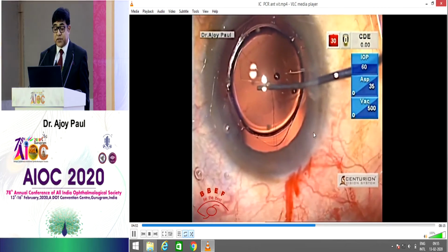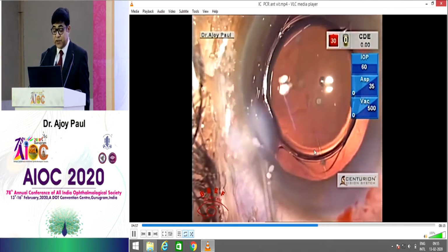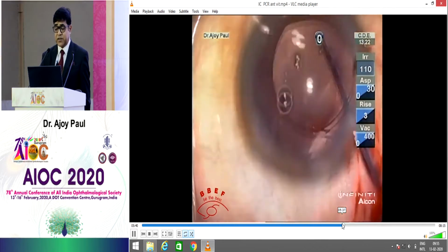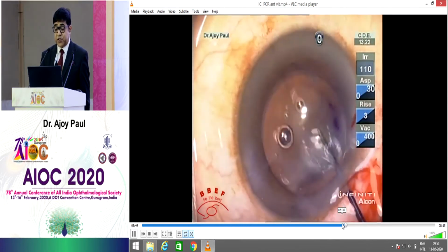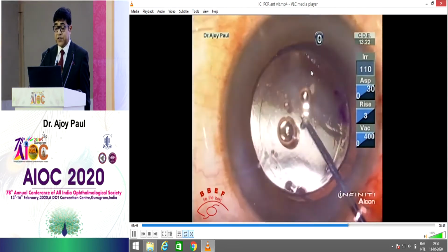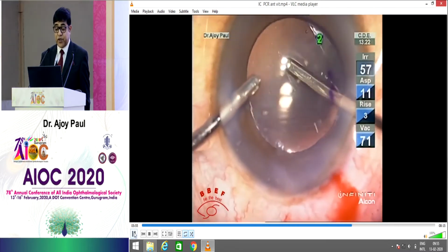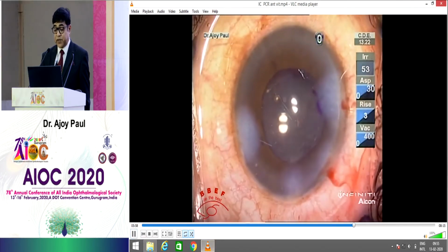See, that's it, and you have got a combination of lens in the bag and part of the lens, the haptic, in the sulcus. The second last case again, how to get your IOL capture. Just push it there. You will have to get it in the oval shape. Now look at this. This is the oval anterior capsule. Once the two haptics are there, this is the right way to get it, well round center and oval.